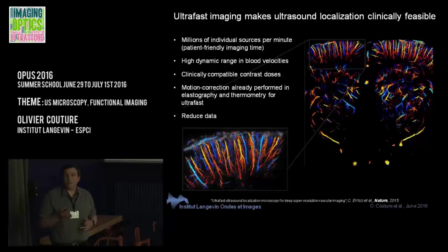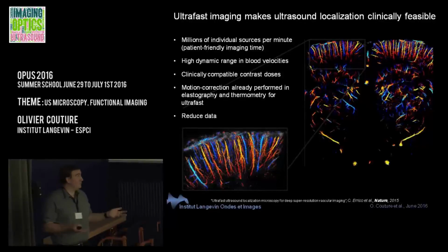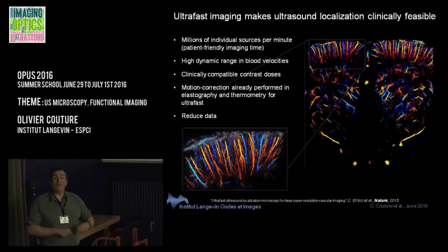But it moves a lot, so you have to correct, and you have to correct in the 3 dimensions. If you have to correct in 3 dimensions, you need a 2D matrix doing plane wave imaging. If you do that, you need thousands of channels, and so you need a lot of money. So currently we're limited with the amount of material that we can use for that.